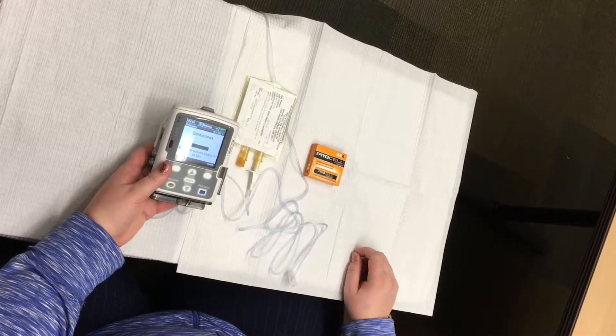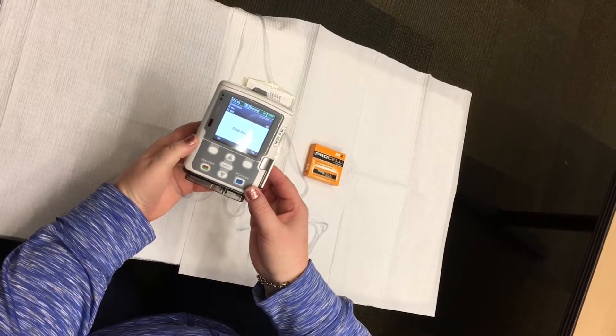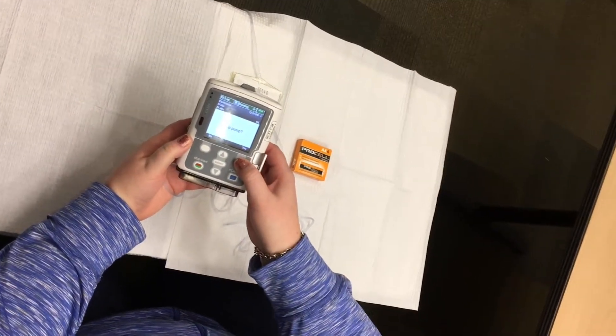To change the battery, stop the pump by pressing the start/stop button. When you see the word 'stop pump,' press the white button below yes.